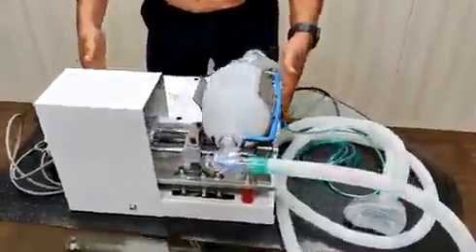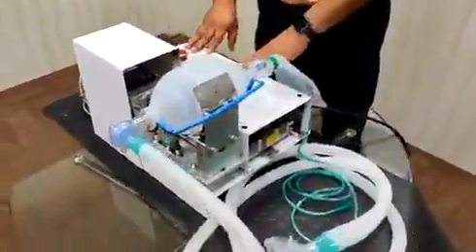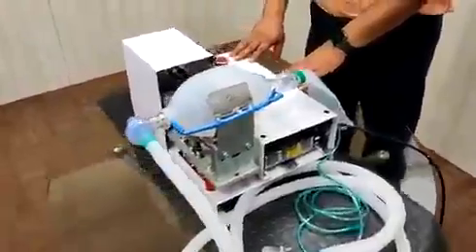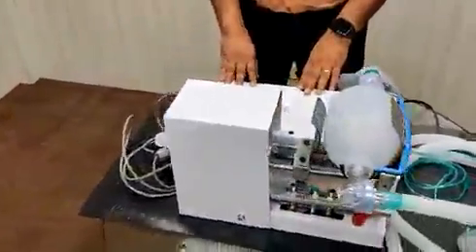There is an inbuilt logic in this device: if for some reason the machine stops, there will be an alarm for the attendant or doctor to come and attend to the patient. In that case, the BVM bag can be operated manually.